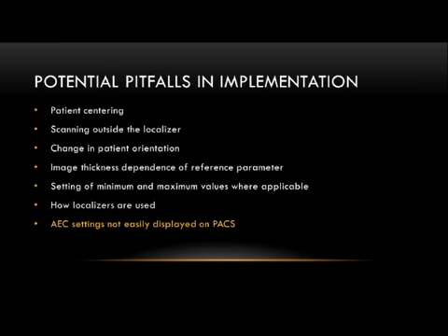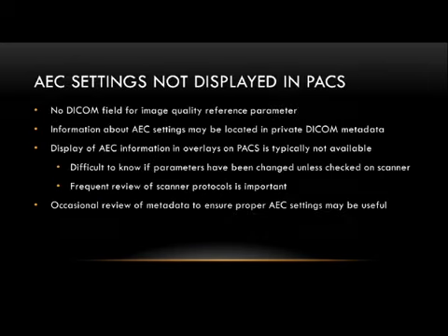Another pitfall, and this isn't so much in scanning systems, but in evaluating after the fact whether the AEC systems and the tube current modulation are working well, is that pretty much none of these parameters get displayed on PACS as overlays. The reason is that a lot of them are not stored in standard DICOM fields. A lot of them are private DICOM data, and that means a lot of PACS systems won't pull in data from non-standard fields to include an overlay.